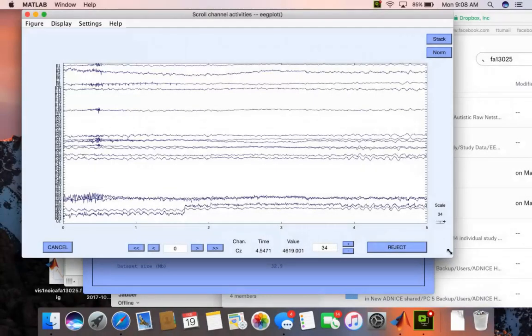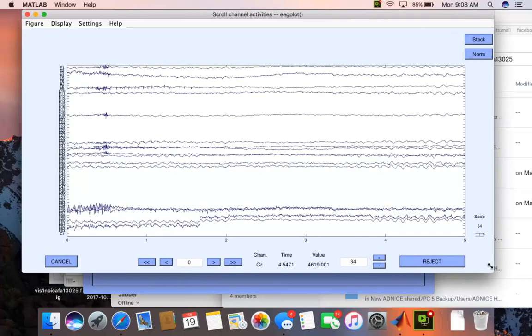Hello, what I want to talk about is beginning to look at some real data. We're at a point in the course where we have looked at frequency analysis and time domain analysis, and we've talked a little bit, or are going to talk a little bit, about filtering and the importance of filtering.